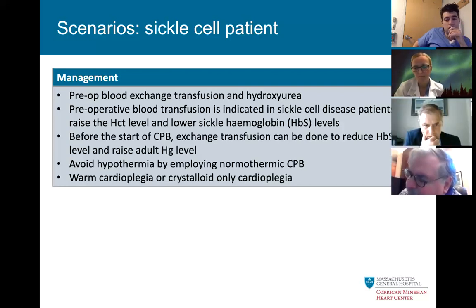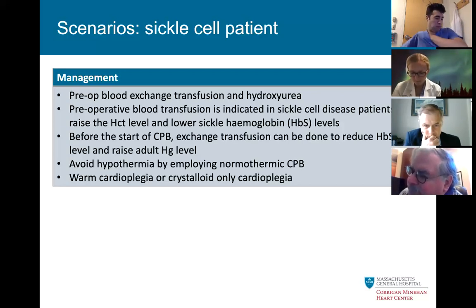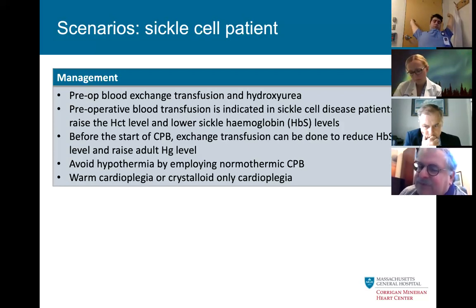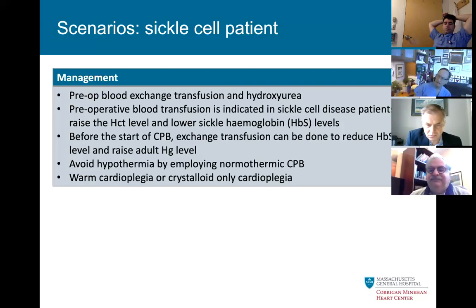Would anyone here give cold crystalloid cardioplegia to someone with cold agglutinins? I've done it. Not a problem. And I've used the Daggett dilute blood cardioplegia, because you're diluting the agglutinin at the same time, and it's just not an issue. George, why not? I just would worry about the blood that is present in the heart when you give the cardioplegia. I don't know if it's a critical mass, but there's already blood in the heart, so I'd worry that you'd get agglutination of that blood. I wouldn't worry about it.